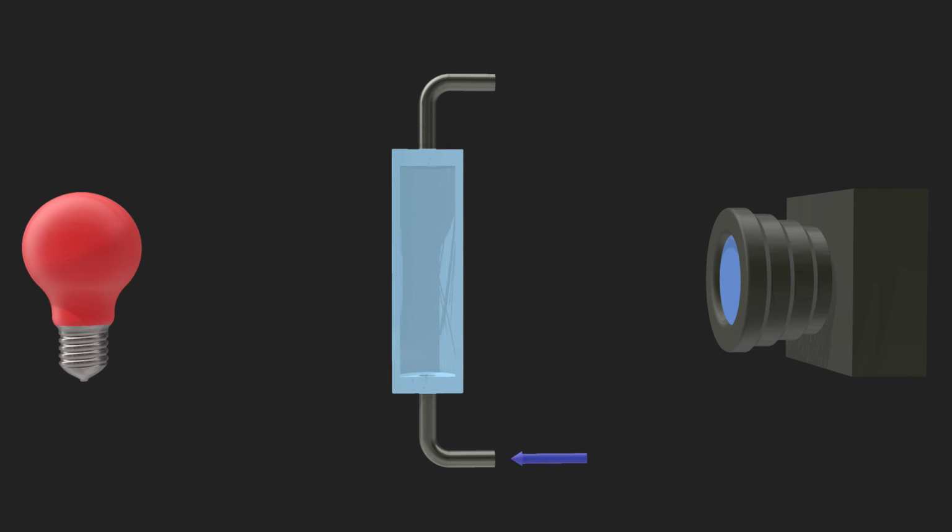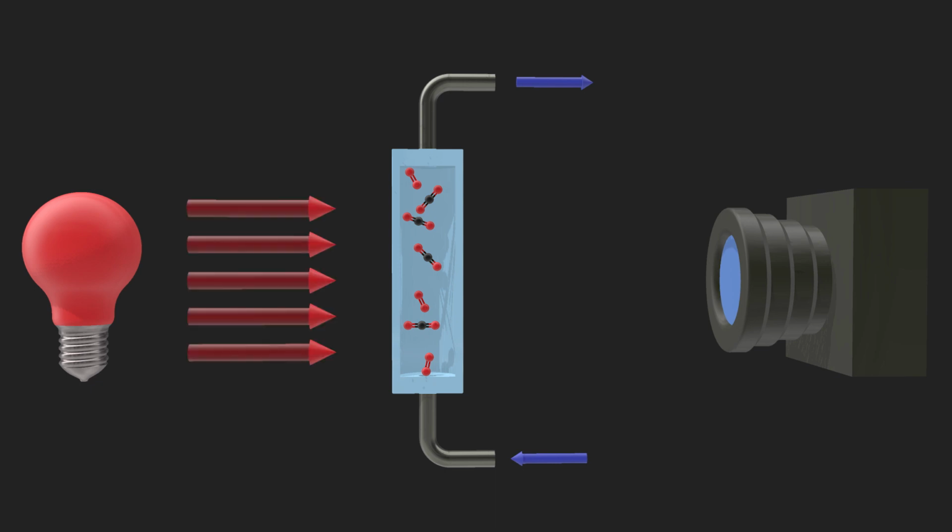The gas sample will flow from the patient's circuit into the detection chamber and back to the patient's circuit. As the gas flows through the detection chamber, the infrared light will pass into the detection chamber where some of the light is absorbed and the remainder is transmitted to the infrared camera where it is recorded by the gas analyzer computer. Note that this diagram represents a simplified version of an IR spectrometer. Real-life implementations would include various mirrors, filters, and prisms depending on the application.